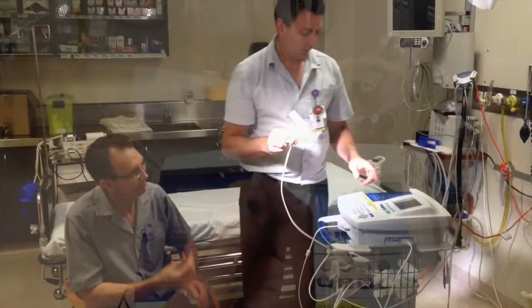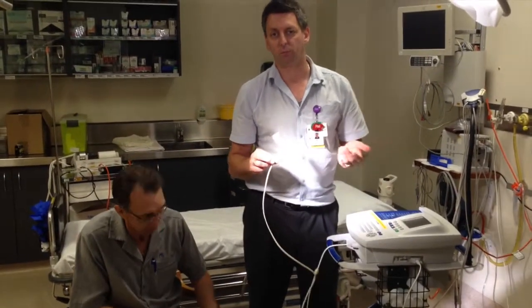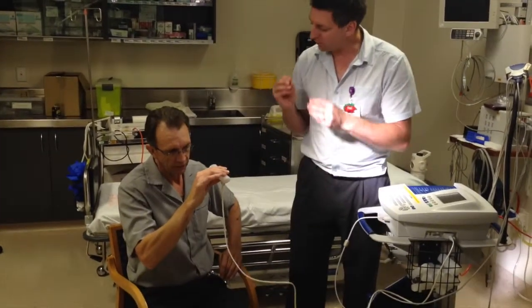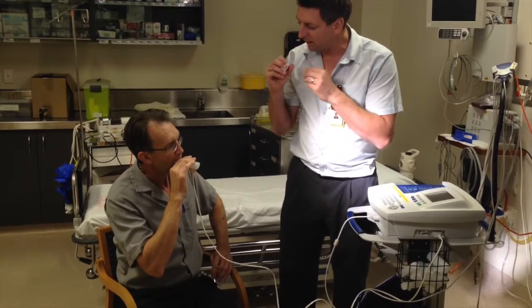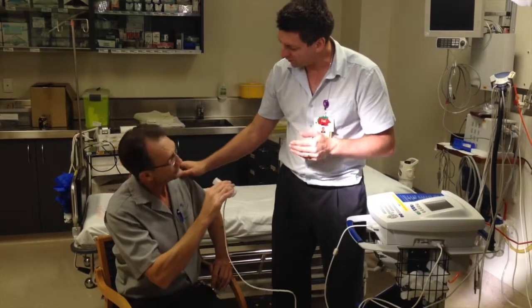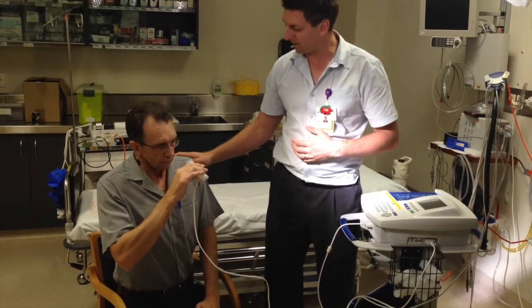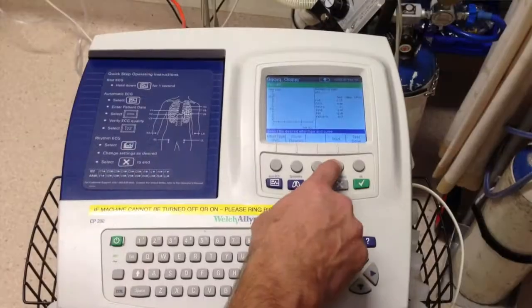On the screen there's a start button. I won't press start until I've told Derek what I'm doing. I'll say: grab the mouthpiece and make a nice seal around the outside. Take it out of your mouth — what I want you to do is take a big breath in and blow out as hard and as fast as you can when I tell you. That's good practice — well done. So we press start.